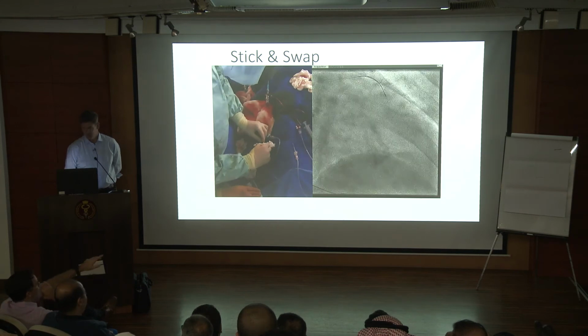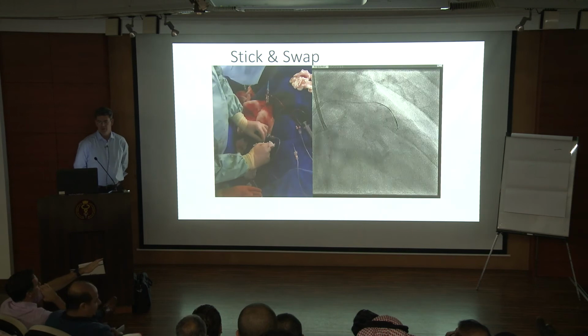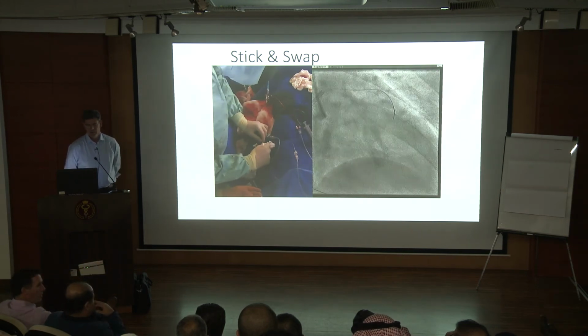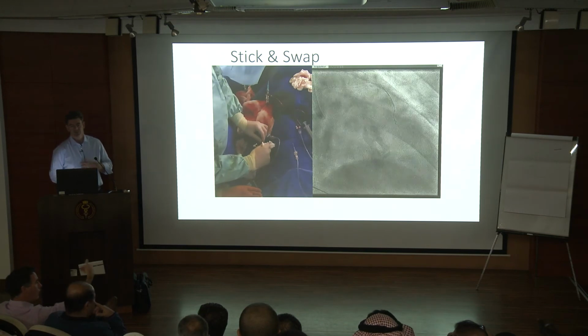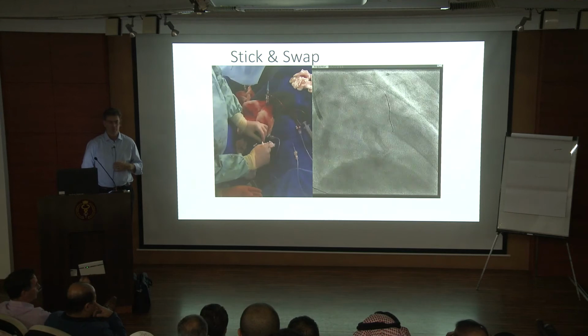If you watch the way the wire flips over, so it comes out the port, down towards 7 o'clock, and then it comes back, flips around there, and drops back in. Yeah. And that's when you know that you're back in. So when you see the wire, you turn it over, you tilt it round, pull it back, and you'll see it collapsing in. That's when you know.